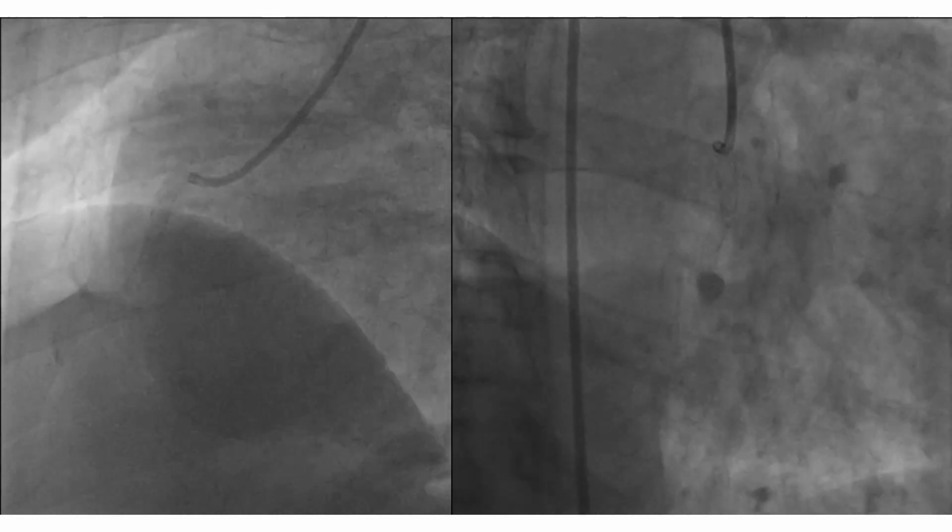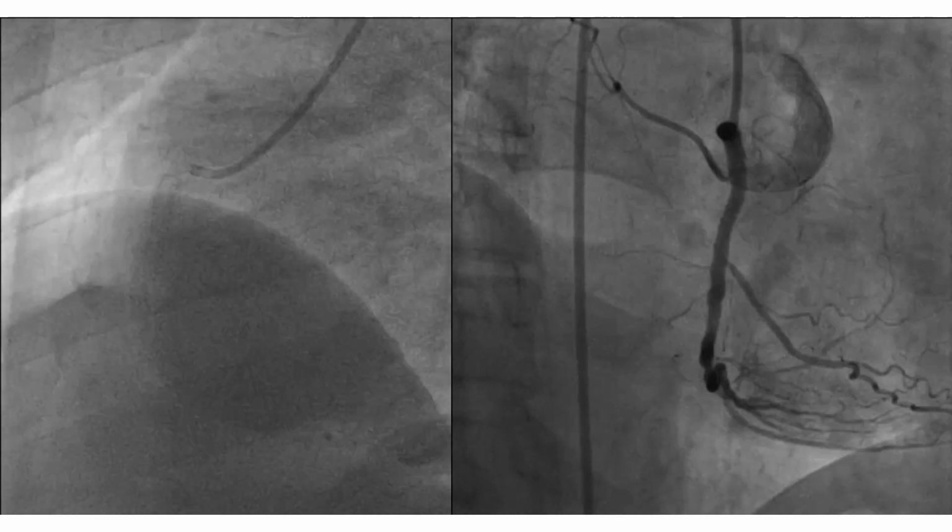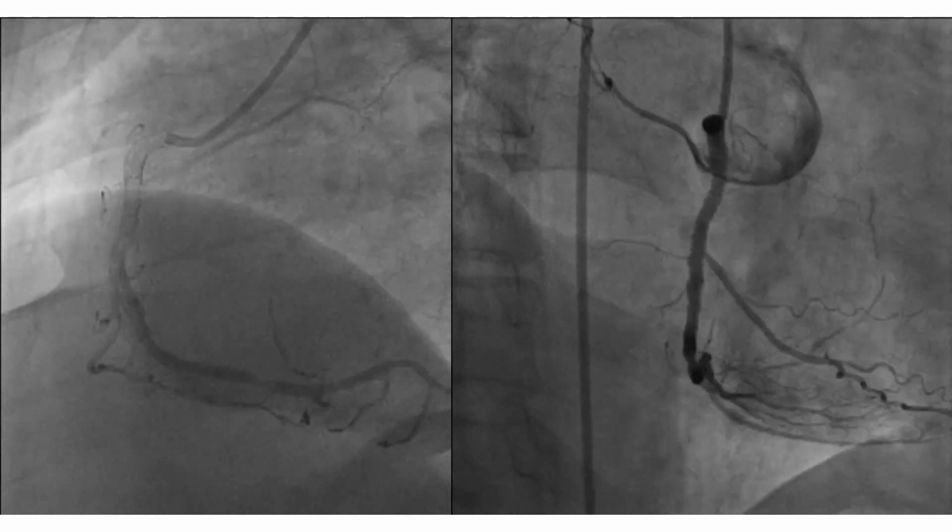Of course, before withdrawing the retrograde wire, you have to make sure that there is no injury done to the donor vessel.